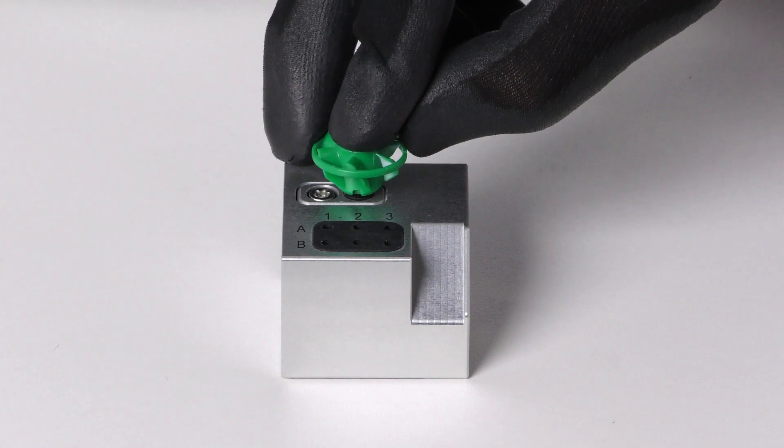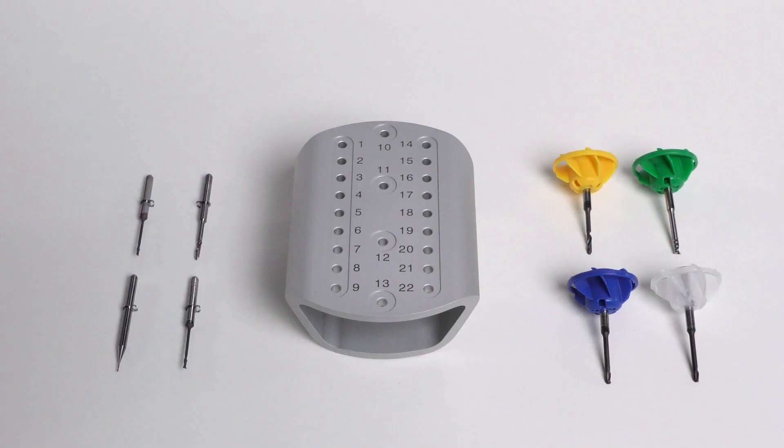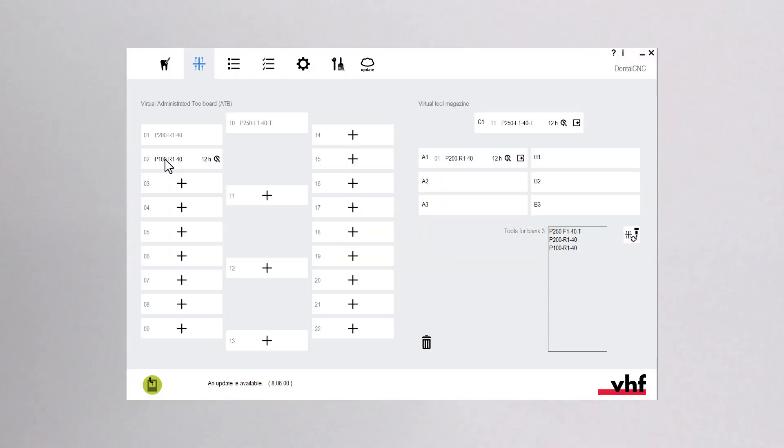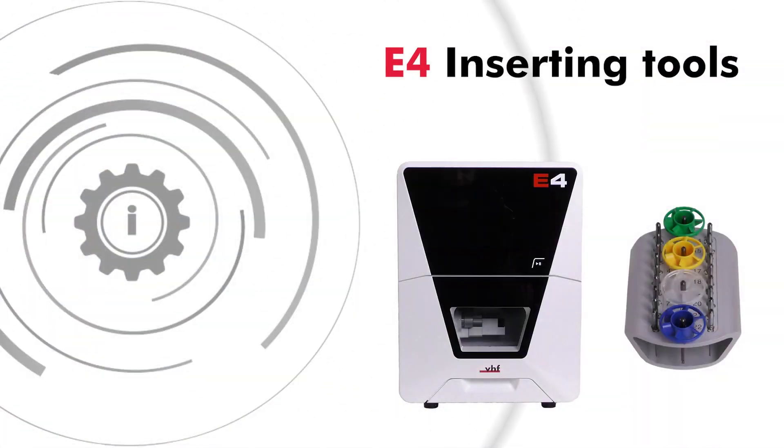In this video, we will show you how to insert dental tools into the tool magazine of the E4. We will also show you how to conveniently store tools in the administrative tool board that is provided with the optional dry machining set.